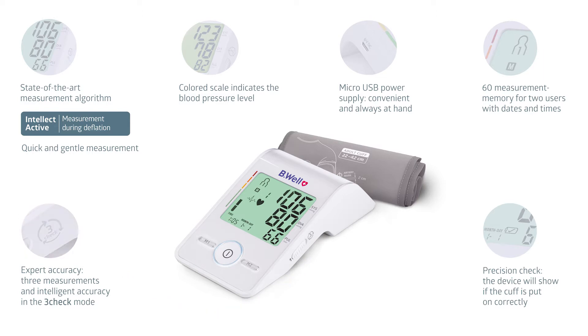The color backlight of the display — green, yellow, or red — enables you to immediately determine to which level the measured blood pressure belongs. The innovative intellect-active technology allows measurements to be taken already at the stage of air injection into the cuff. The blood pressure monitor adapts to each user by determining the level of pumping the cuff for each person individually.